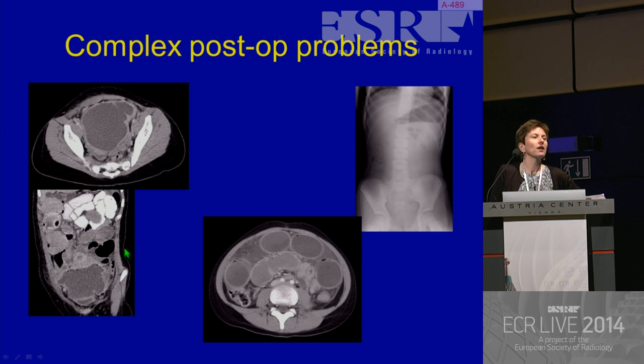So if they are smaller, deep pelvic abscesses, I would say maybe sometimes we don't get the full definition with CT. I drained 200 mils of pus out of that under ultrasound guidance. So occasionally, pragmatism, or sometimes in a non-pediatric hospital, this kind of scan gets done.